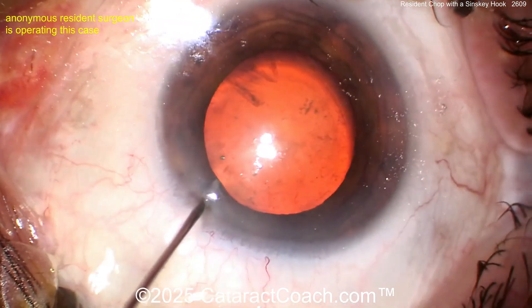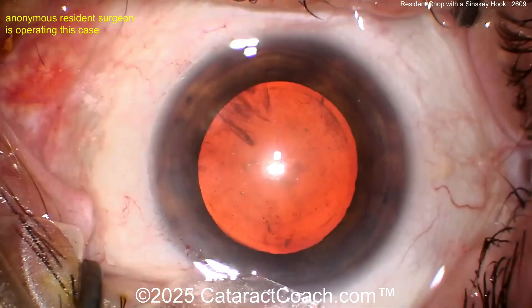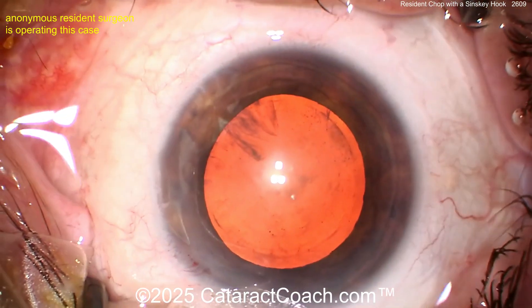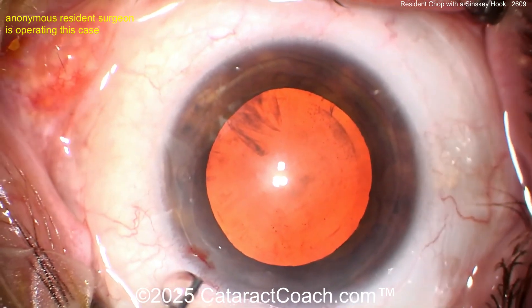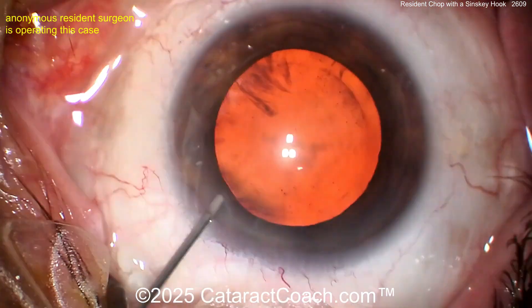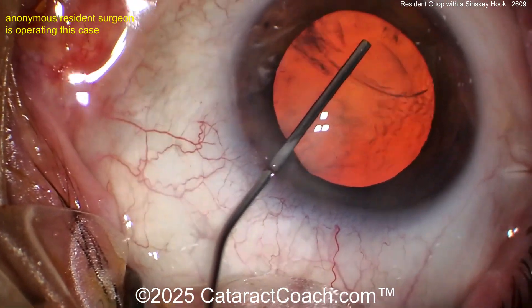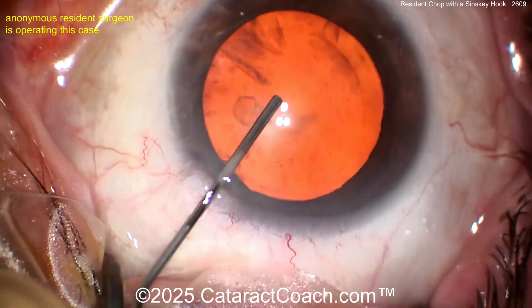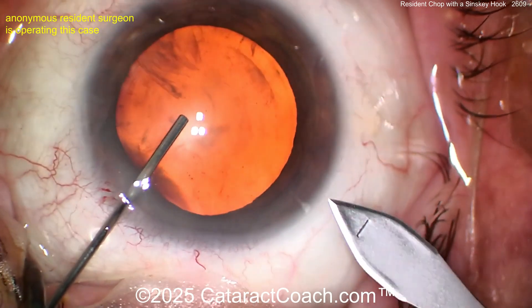I see some of the eyelashes there, and a lot of gooey stuff in the tear film. You know how Cataract Coach does not like this. You can try to wash it away, but because you have not sequestered the lid margin, you're going to be dealing with the gooey gross lid secretion the entire case. Next time, just do it the Cataract Coach way.